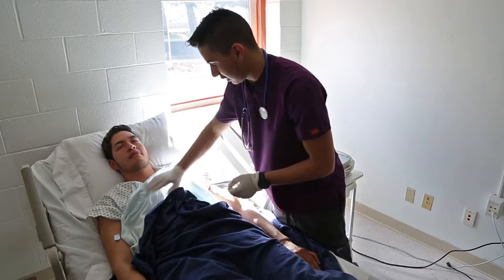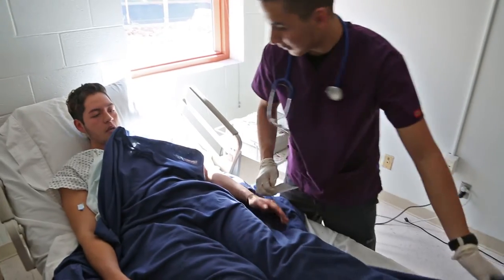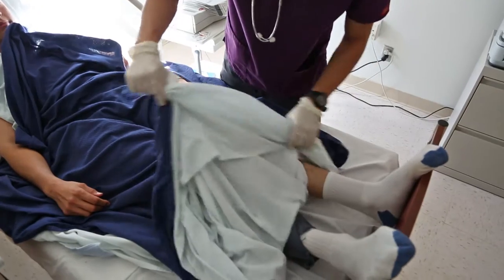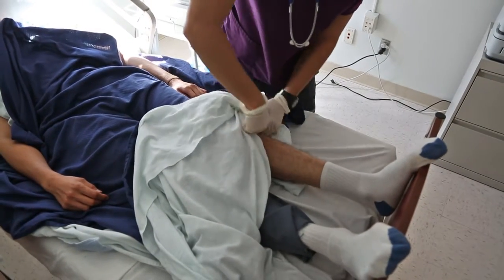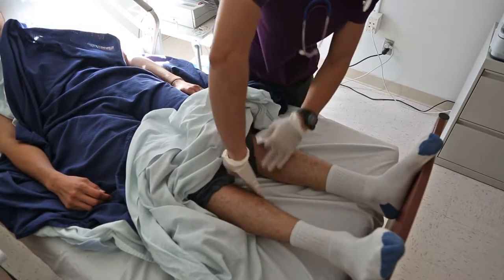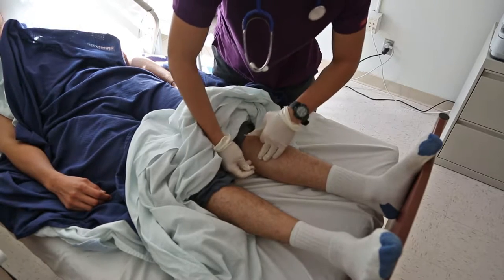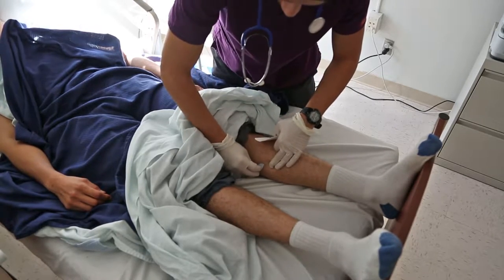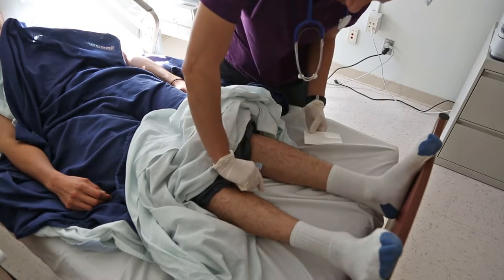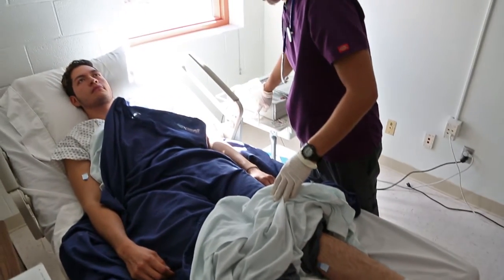Make sure the electrodes stick and let's move down to his legs. We're going to be uncovering your legs. You want to roll up his pants. You want to try to put the electrode on the inside of the legs facing up — we do this so it's easier and there is no pulling on our leads. Make sure you put them on the same level as well. We're all ready to set our leads.